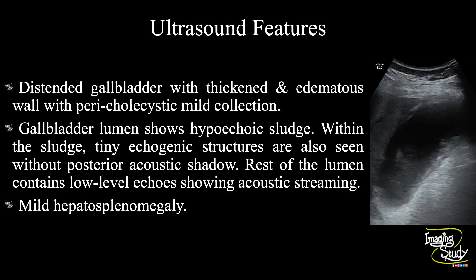In summary, a distended gallbladder with thickened and edematous wall is seen with pericholecystic mild collection. The gallbladder lumen shows hypoechoic sludge, and within the sludge there are tiny echogenic structures without posterior acoustic shadow indicating microcalculi or soft calculi. The rest of the lumen contains low-level echoes showing acoustic streaming, indicating a pus component. There is also mild hepatosplenomegaly. These features conclude this as a case of acute cholecystitis with soft calculi or microcalculi, biliary sludge, and features of empyema gallbladder.